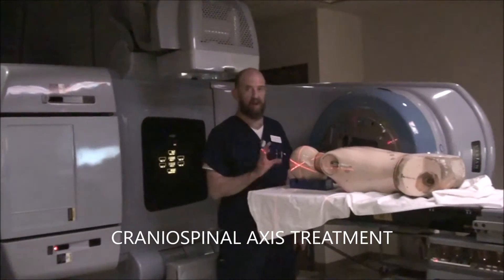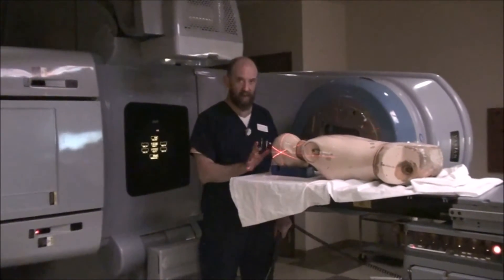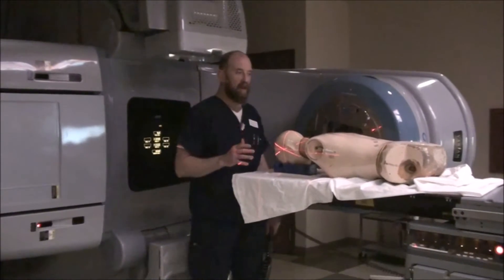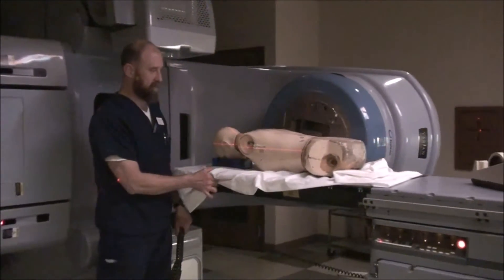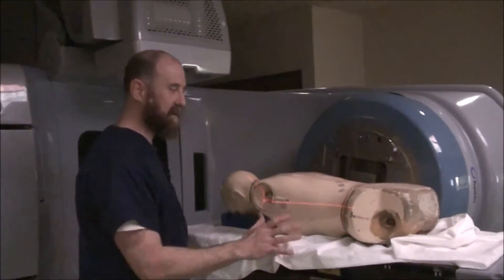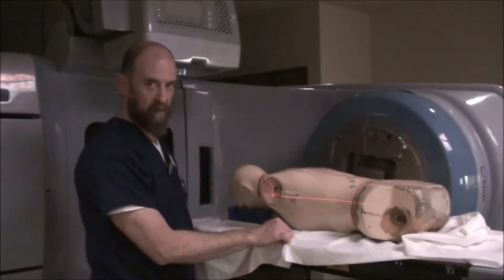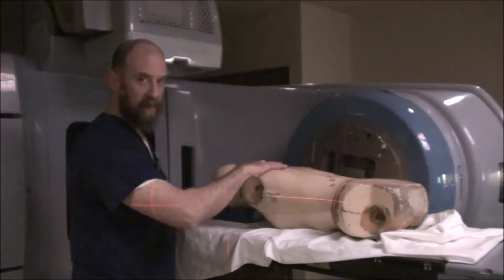To treat the cranial spinal axis, you're going to start from the head. The first thing you want to do when you get the patient on the table is get them in position. You potentially are going to have lateral leveling marks on the patient. Get them leveled. We're just going to get them leveled out all the way along the torso and the hip so that all of this is in line with itself.